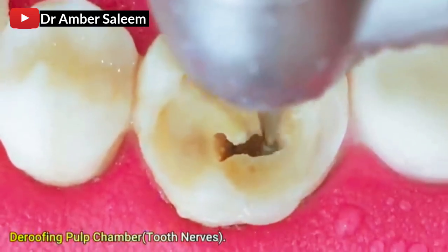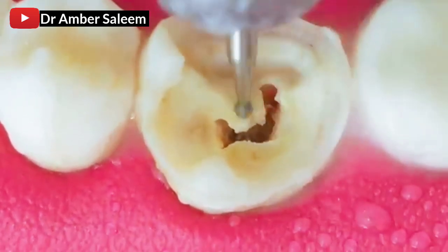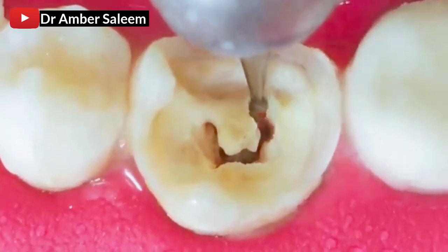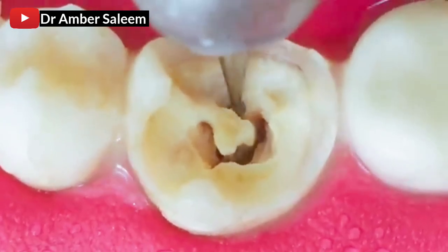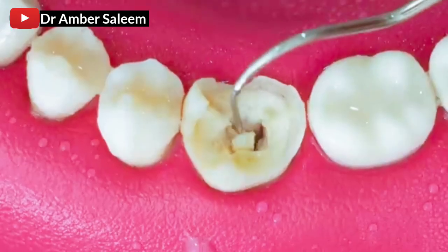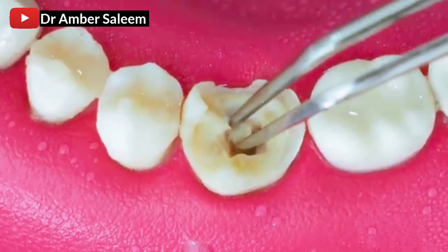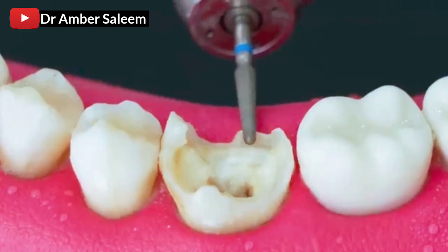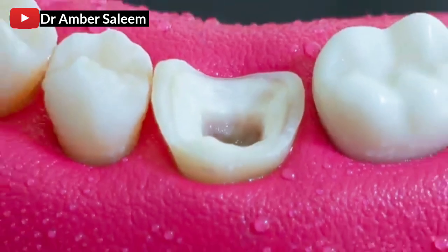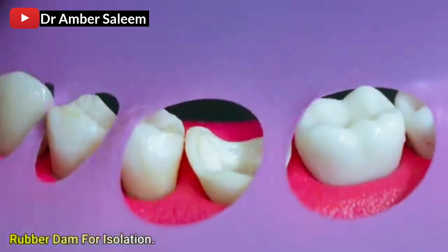Deroofing the pulp chamber to expose the root canal nerves. Rubber dam applied for isolation.